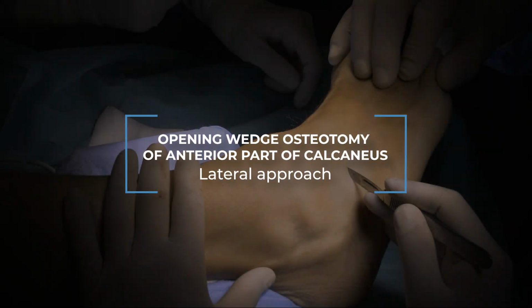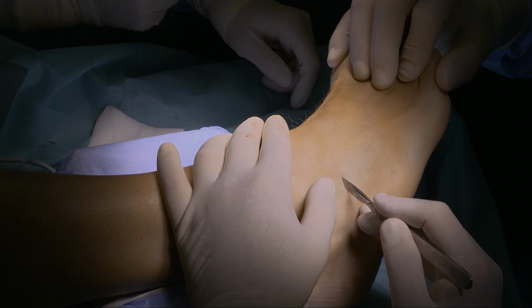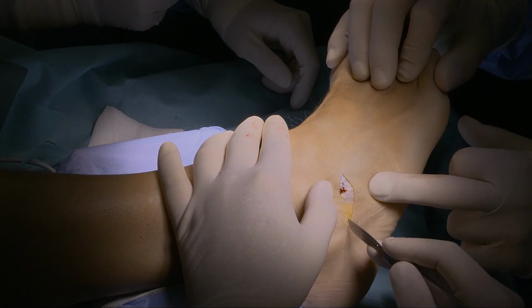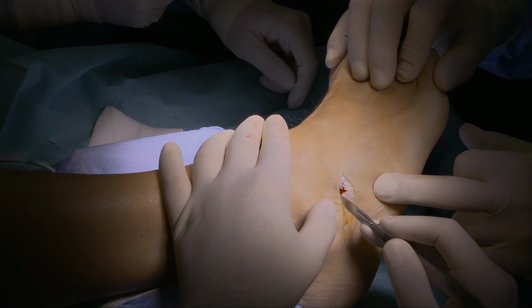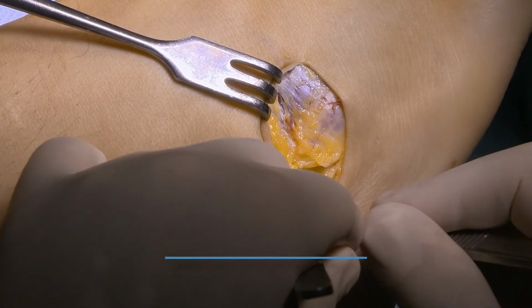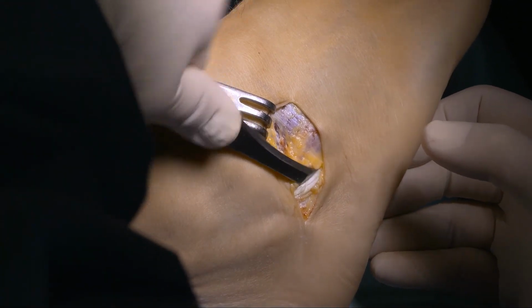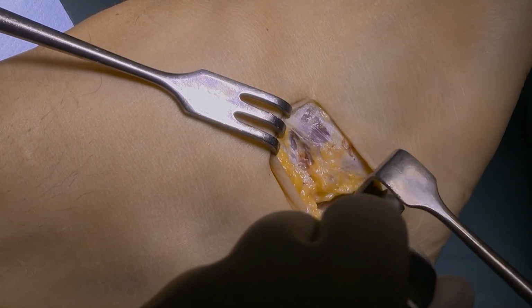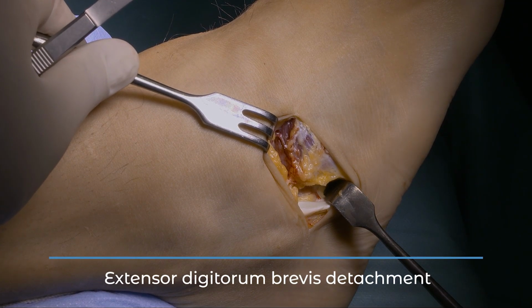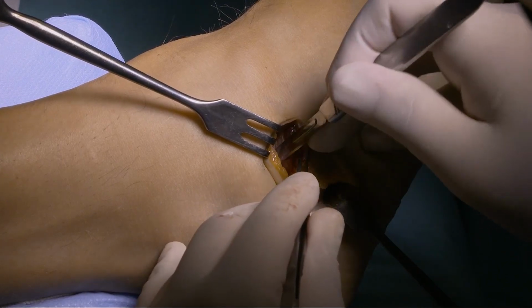The next stage of the operation is opening wedge osteotomy of the anterior part of the calcaneus. Lateral approach, mini Ollier. Fibular muscle tendons are visible and retracted, and the extensor digitorum brevis is detached.